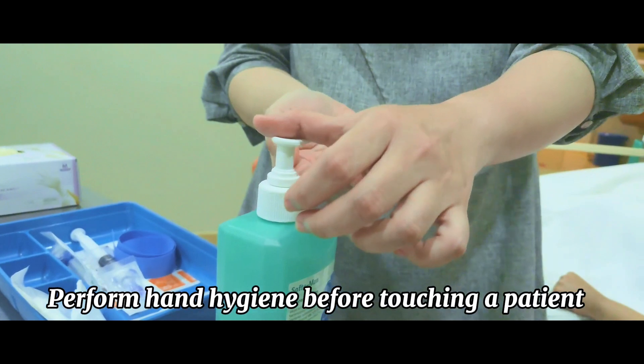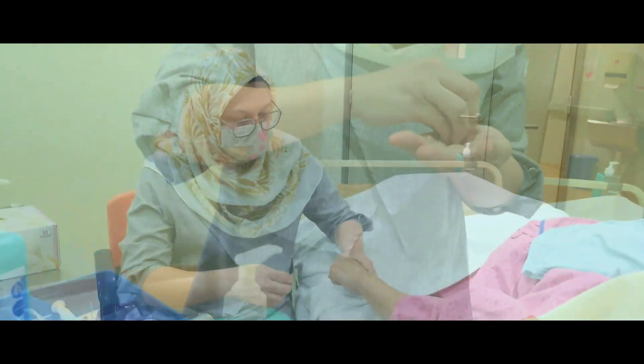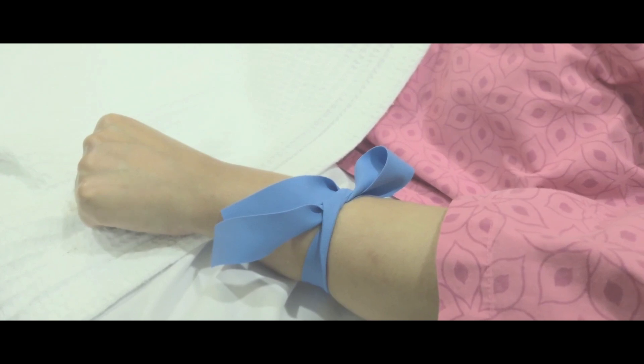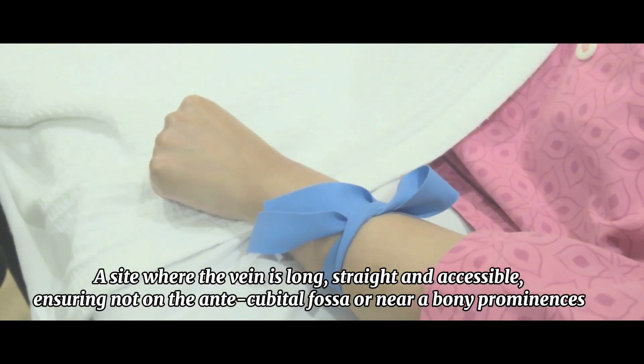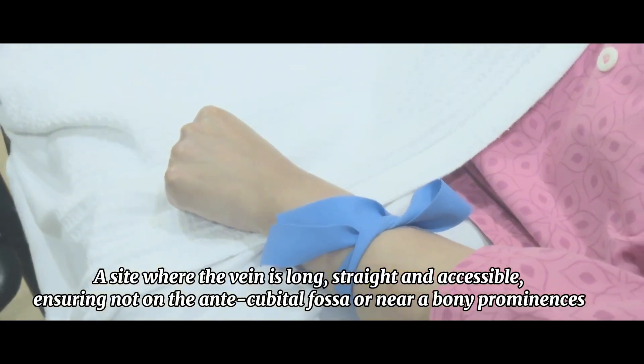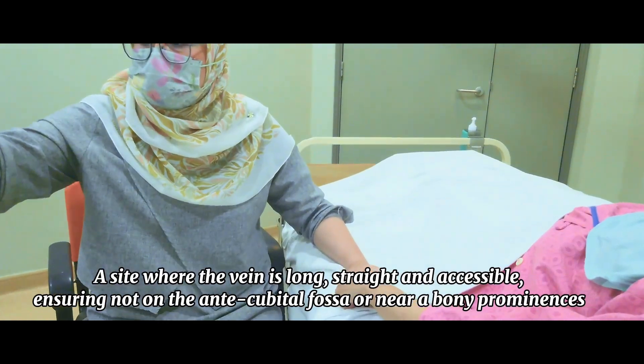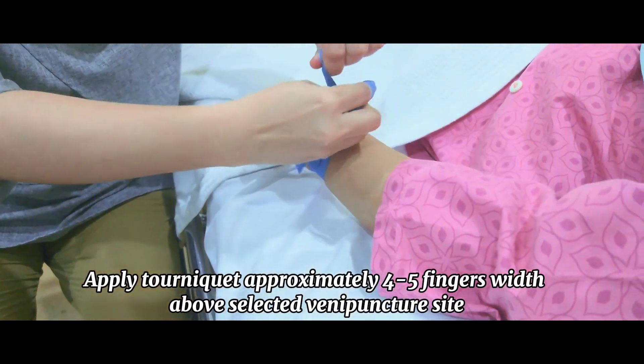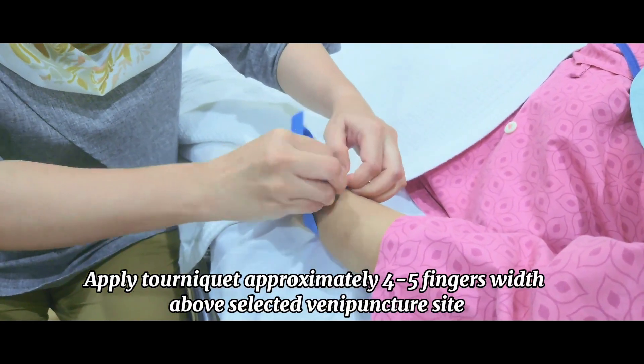Perform hand hygiene before touching the patient. Select the appropriate vein for insertion — a site where the vein is long, straight, and accessible, ensuring it is not on the antecubital fossa or near bony prominences. Apply the tourniquet approximately four to five fingers' width above the selected venipuncture site.